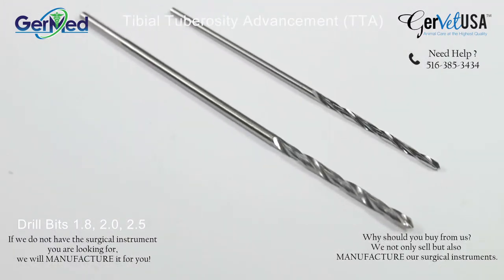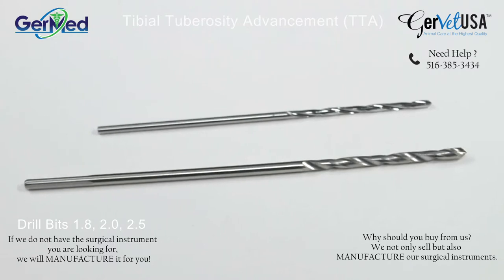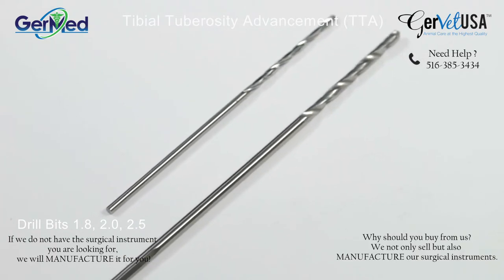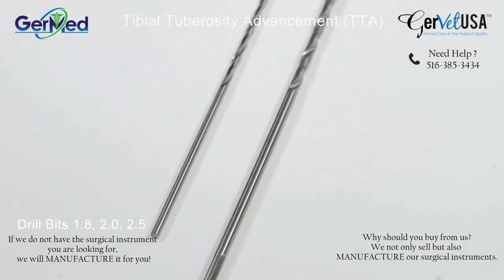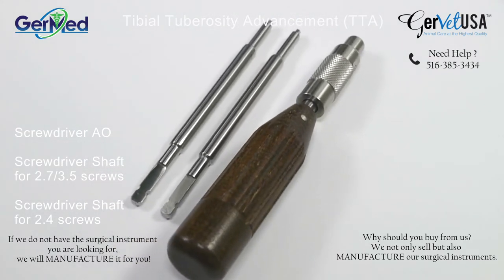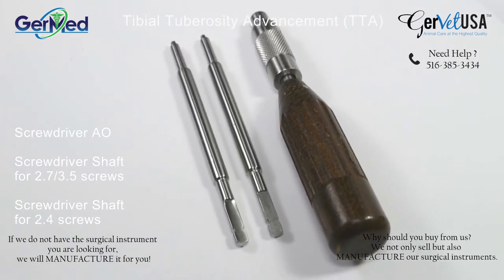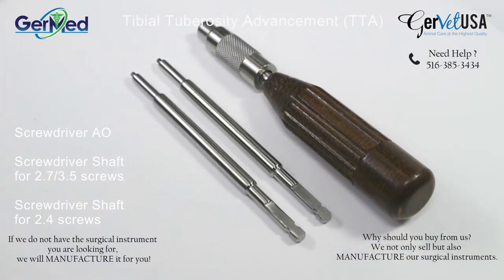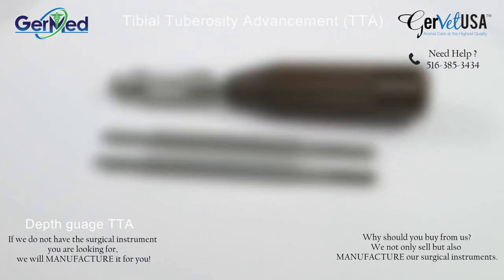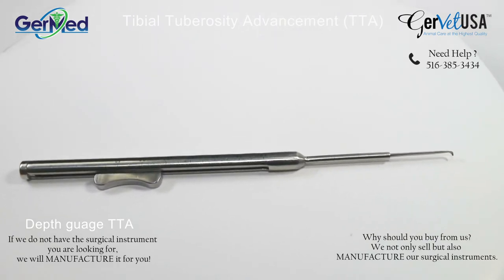1.8 millimeter drill bits, self-centered, 2.0 millimeter drill bits, plain shaft, 2.5 millimeter drill bits, plain shaft, screwdriver with AO grip, screwdriver shaft for 2.7 and 3.5 millimeter screw, screwdriver shaft for 2.4 millimeter hex screw, and a depth gauge TTA for 160 and 40 millimeters.